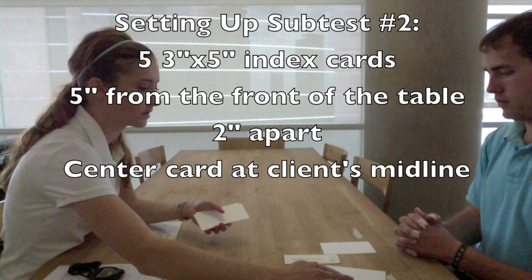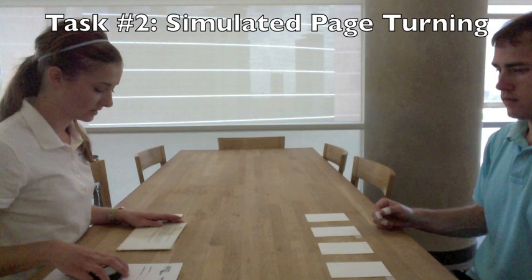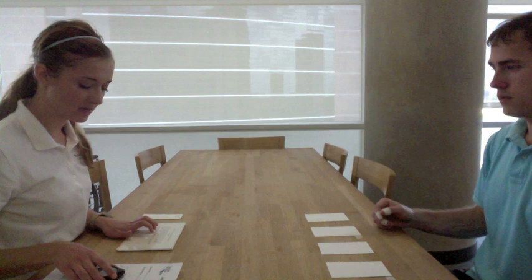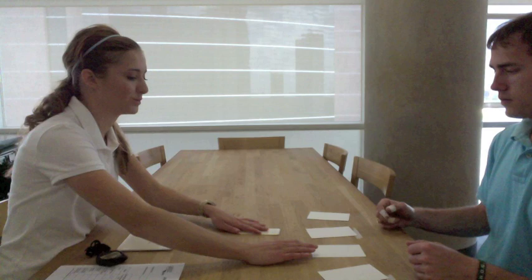The therapist organizes the materials, then instructs: 'Place your left hand on the table. When I say go, use your left hand to turn these cards over one at a time as quickly as you can, beginning with this one. You may turn them over in any way that you wish and they do not need to be in a neat pattern when you finish.' After the left hand completes the task, the right hand repeats the same procedure.